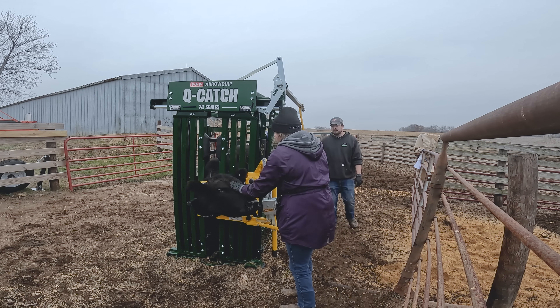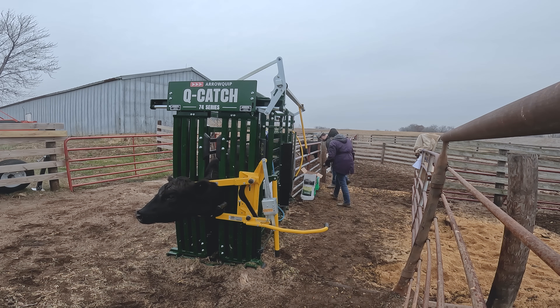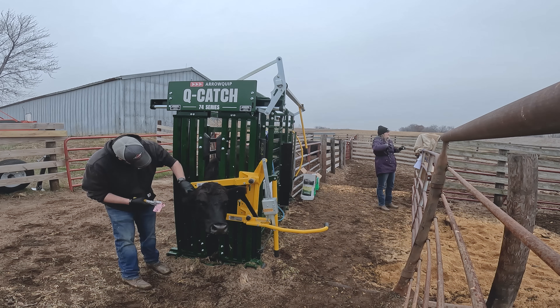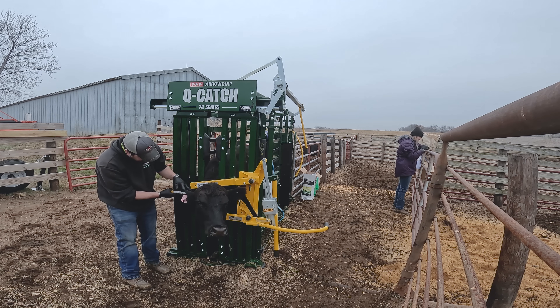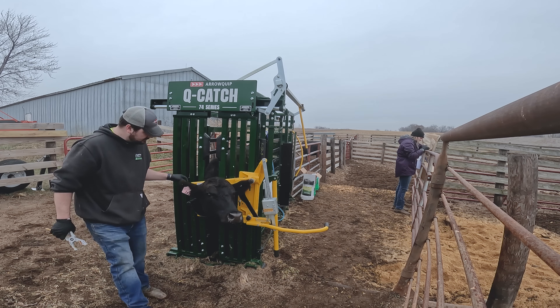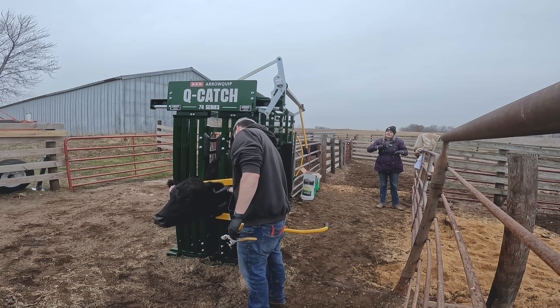Working through the next cow — we have a 26. She lost her sticker, so we need to find a replacement. These RFID things are a good idea. Brand new cow — swapping in a fresh needle and getting her ready for the draw.